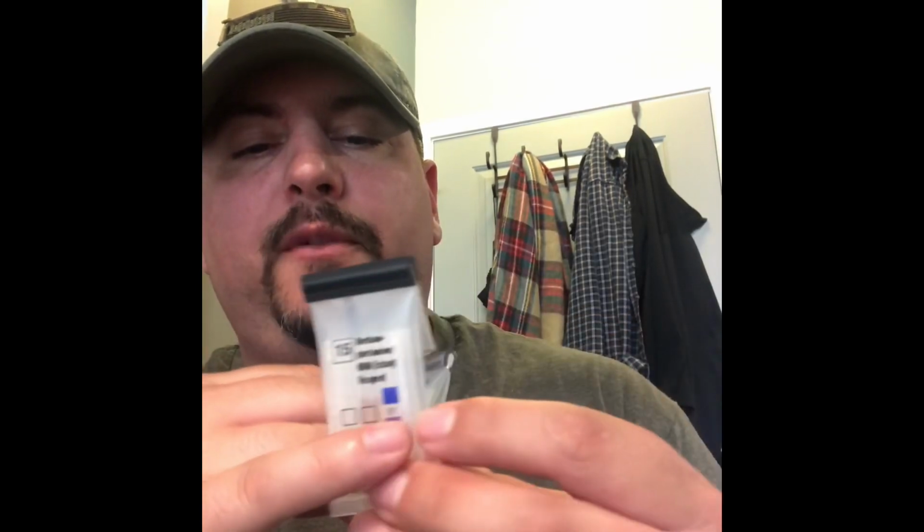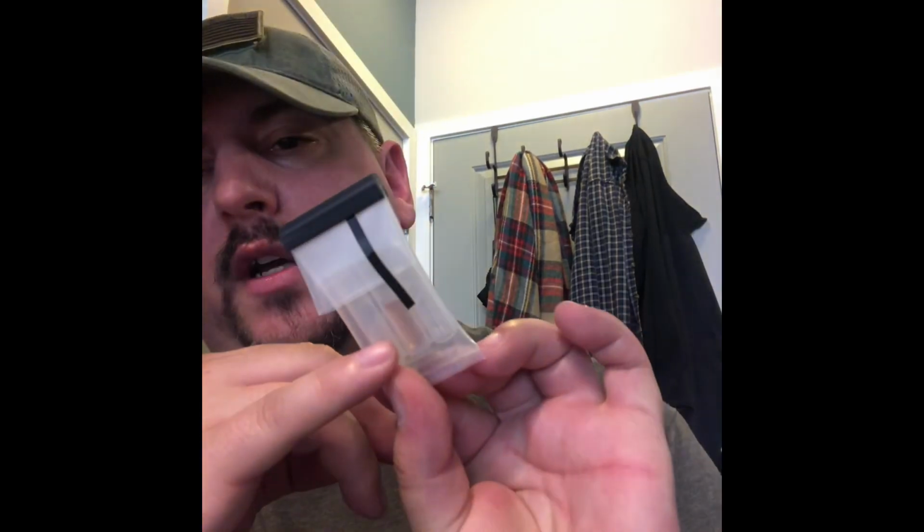So I have heroin here. You're going to break the ampules left to right. There's two, and a spot for the third in the middle. These other ones do have all three. You have to break all three. You see the center one is already colored as it is. So we break this one first. You got to shake these for about 30 seconds.